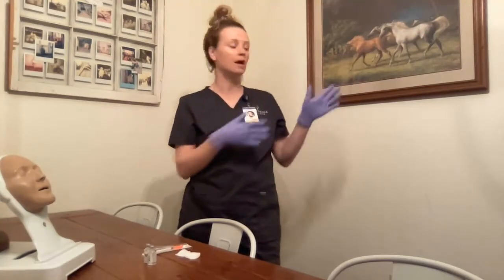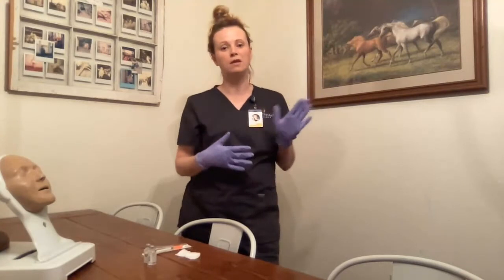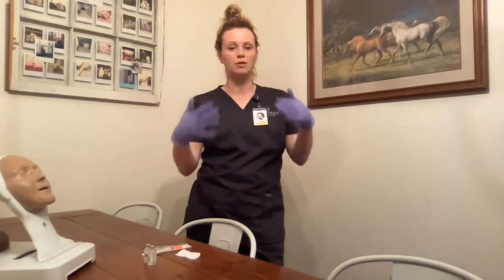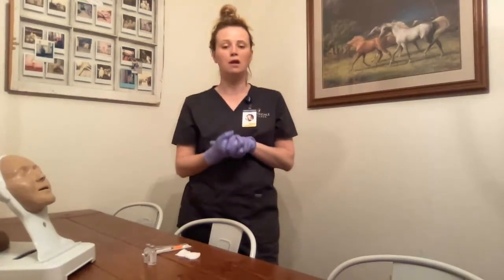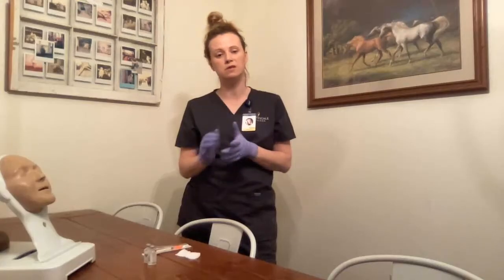From this point, I have another nurse here with me. We will both be verifying the amount for each medication and then the total amount each time against the MAR. To reiterate: my patient will be receiving four units of regular and eight units of intermediate NPH, totaling out to 12 units of insulin.